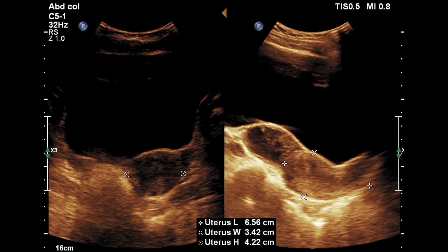Here you can see the longitudinal and transverse section of the uterus. The measurements are within normal limits.